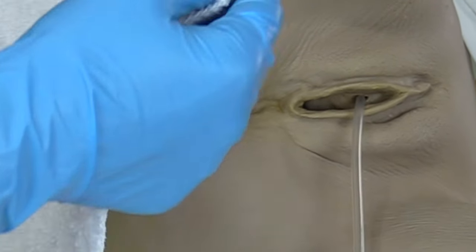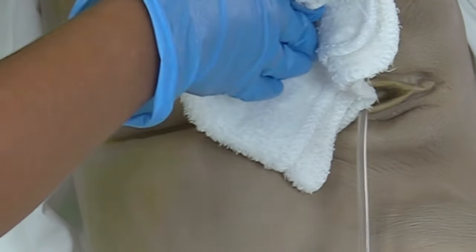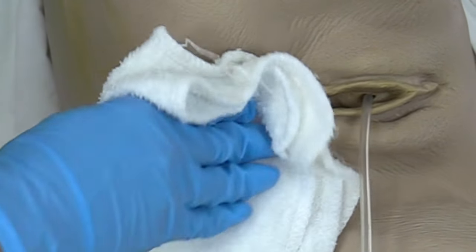We got a new cloth that has soap and water on it, and we're gonna fold it into our leaves. And we're gonna start on the cheek that's furthest away, and we're gonna go from front to back because we don't wanna go from back to front because we would spread germs. And then we're gonna go to the cheek that's closest to us, go from front to back, pull back a new leaf, so we're on our third leaf.